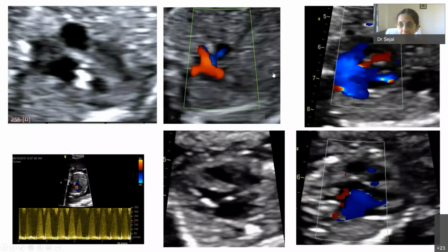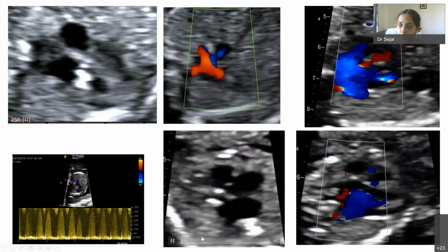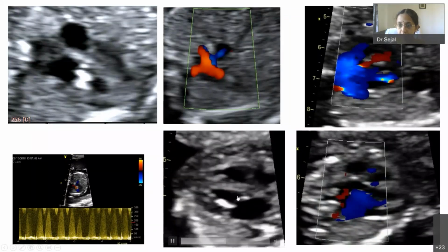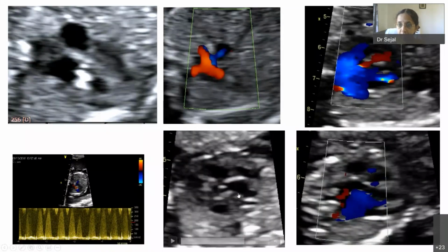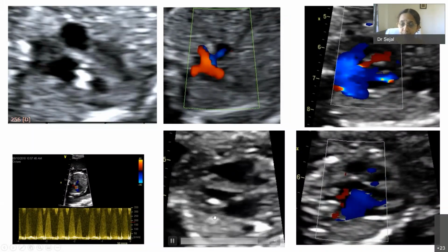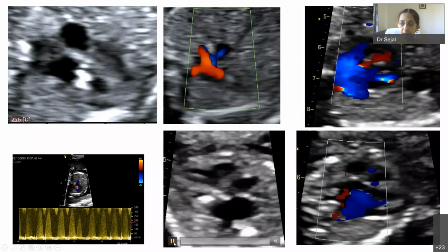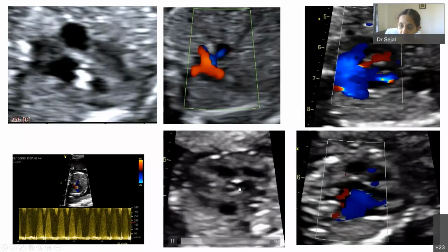Whenever I have this, normally I'm not going to do Dopplers for every single valve, but I will usually see some turbulence here. If my PFO is left to right, I try focusing on the aortic valve. So see, this is the left ventricle, this is the aortic valve. I have a dilated ascending aorta. Now, when I have a dilated ascending aorta, turbulence across the aortic valve, and the left ventricle shows an EFE-like picture. Very good. So it means that my aortic valve cusps are thickened and my ascending aorta is dilated. So I know I have a lesion at the aortic valve.